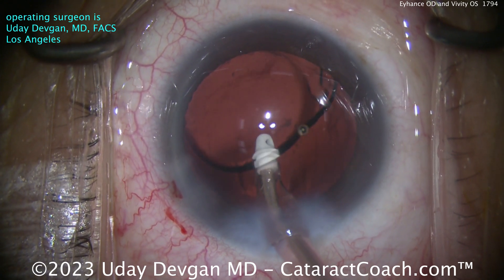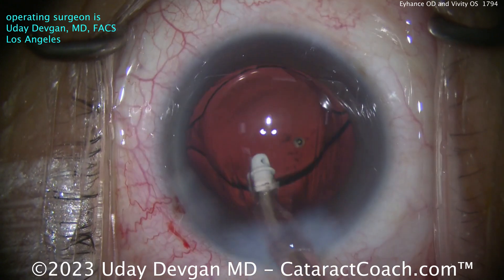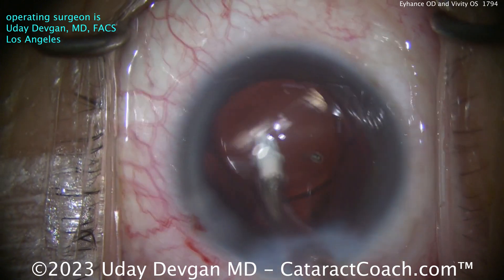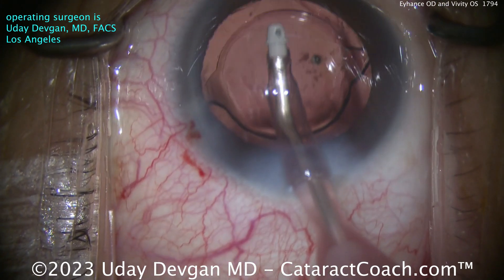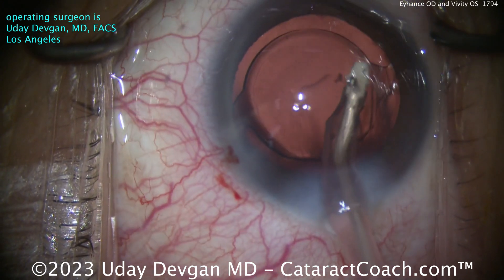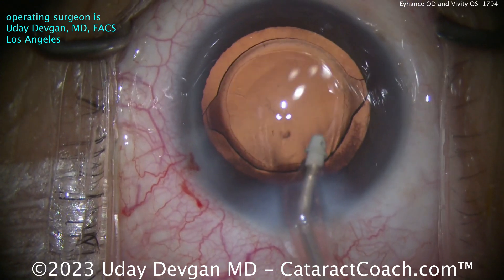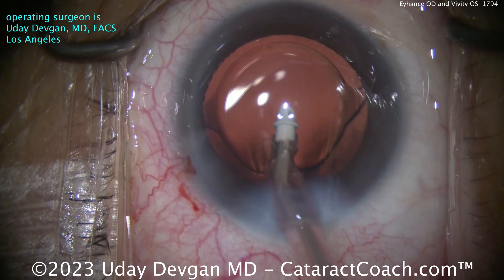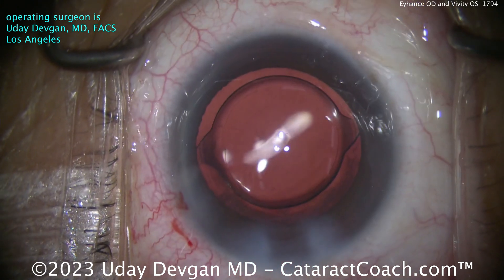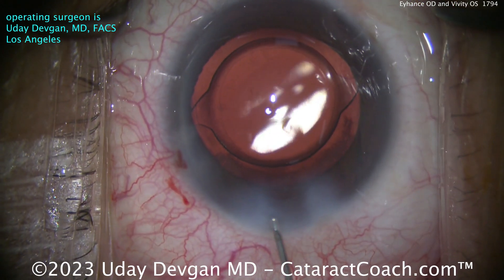Pupil size does make a difference. If the patient has a very large pupil, that central one millimeter zone doesn't mean all that much — you're in a four millimeter pupil. But in the case of a patient with a smaller pupil, say two and a half millimeters, that central one millimeter zone may play a bigger role. While patients do a lot of Google homework, they fail to take into account so many other factors including pupil size. Beautiful looking eye — let's seal up that main incision.